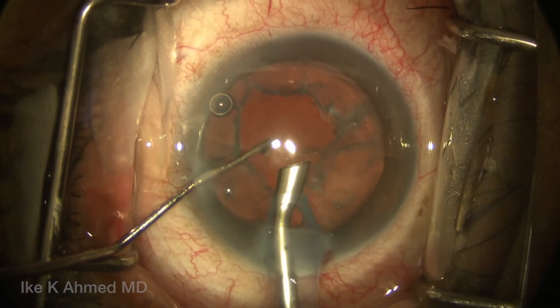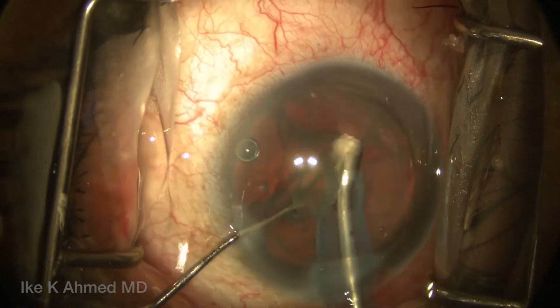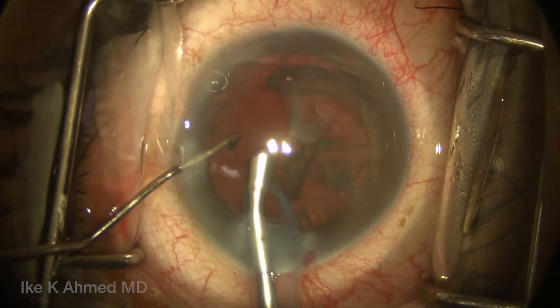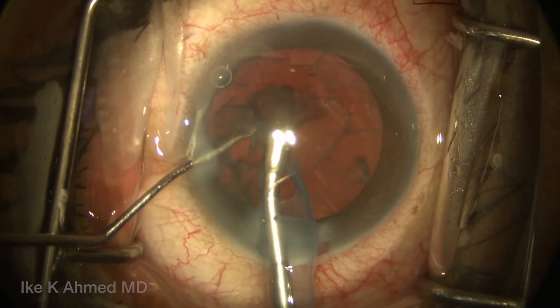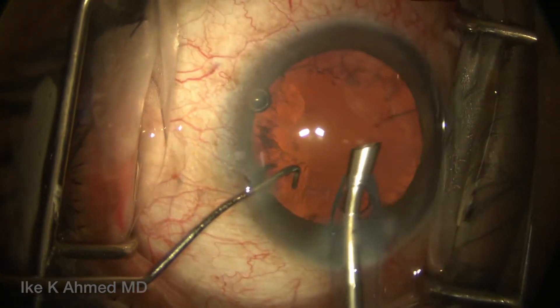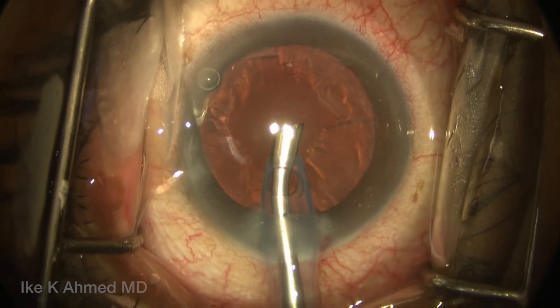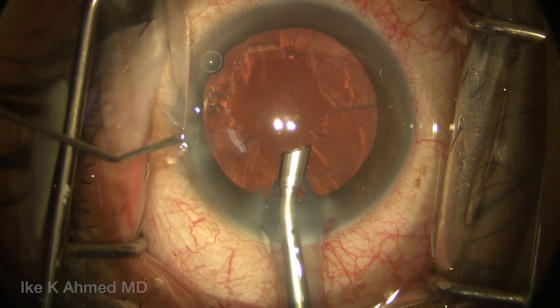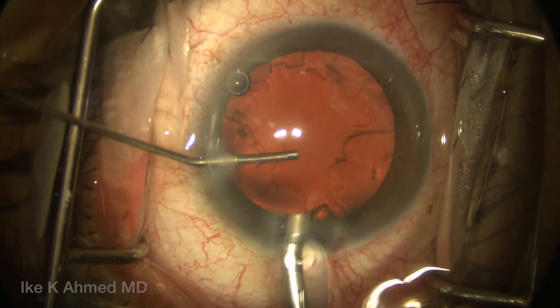The remaining hemi-nucleus is then grabbed nasally and flipped to the center of the anterior chamber and aspirated again with the facility of the chopper. This technique is a fairly effective, efficient procedure for soft to moderate lenses, by using the chopper to crack the lens in half first, and then aspirating each hemi-section by flipping it into the iris plane anterior chamber to safely emulsify the nuclear fragments.